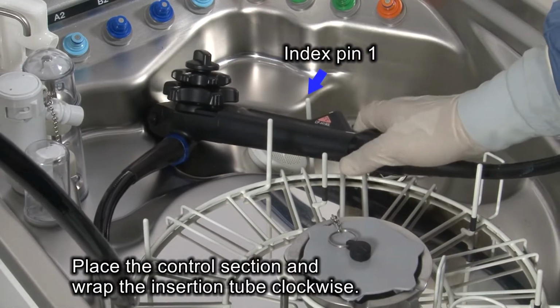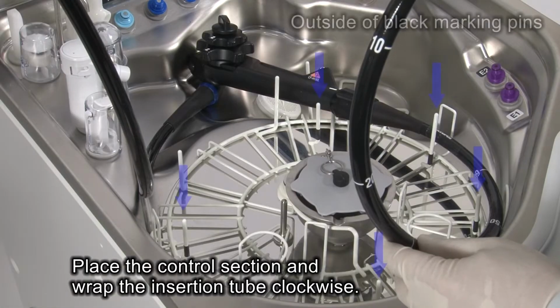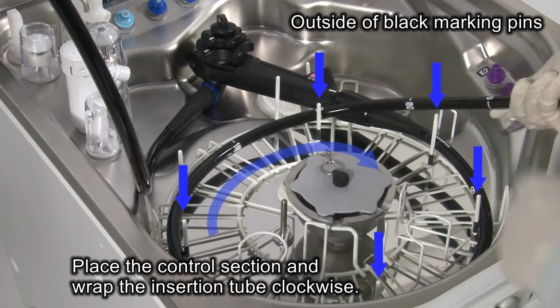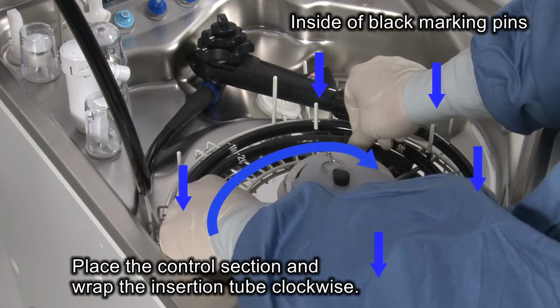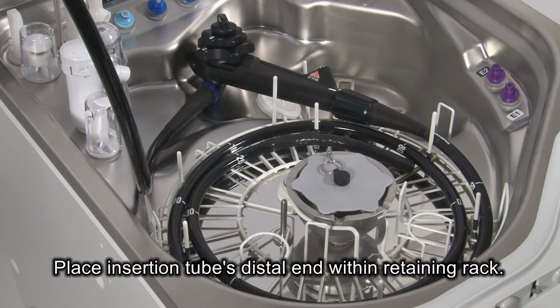Set the endoscope's control section on the left of the index pin on the depressed part of the reprocessing basin and wrap the insertion tube clockwise around the retaining rack from the outside towards the inside. Make sure that the insertion tube's distal end is placed within the retaining rack.